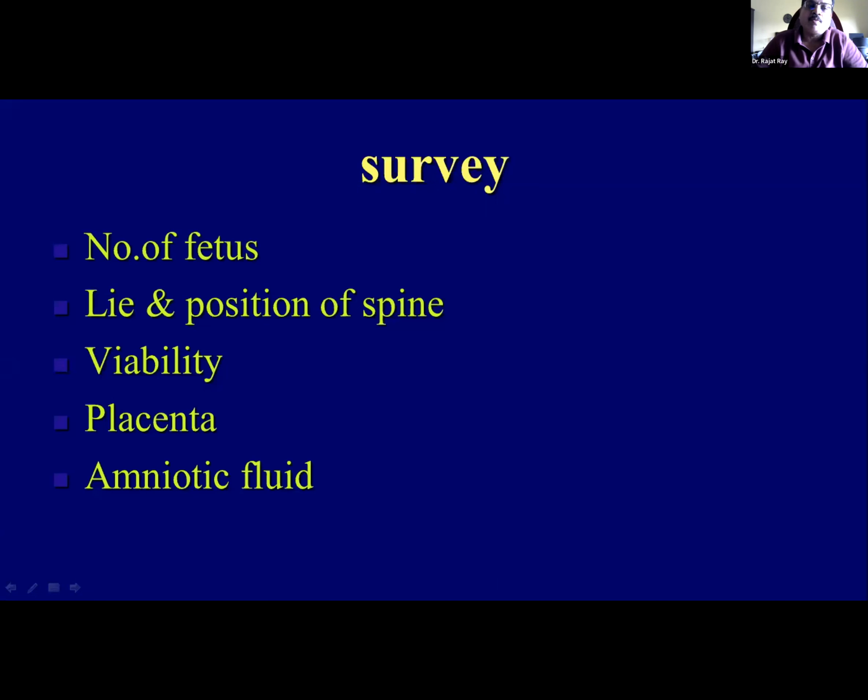So in this survey scan, what do we want to know? We want to know the number of fetuses, lie and position of the spine, viability of the fetus, some knowledge about the placenta, and knowledge of the amniotic fluid.